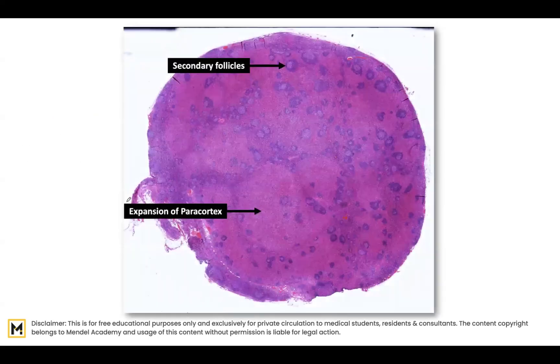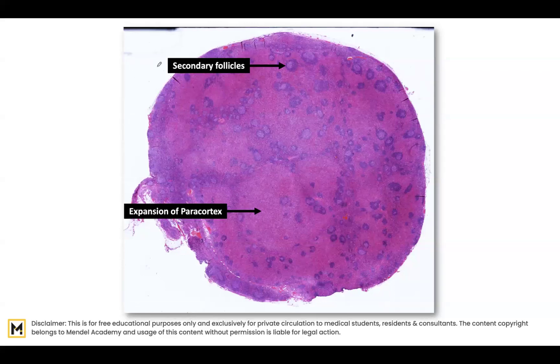Now we return to the histopathology, as we need to know how to report a case of Kimura disease. Under low power or scanner view, you should be able to identify the presence of secondary follicles — meaning they have active germinal centers.